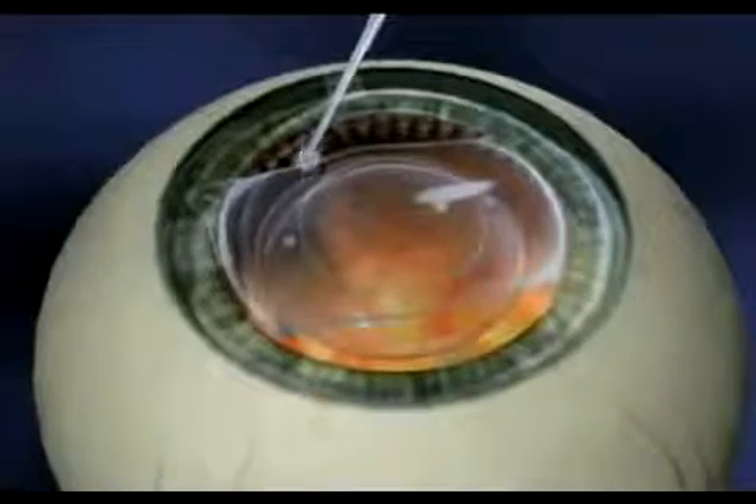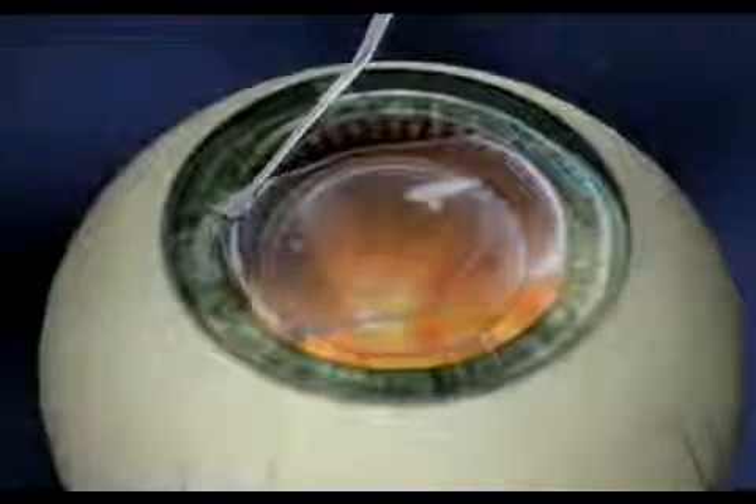Once the lens has fully unfolded, the four corners of the lens will be placed behind your iris. This makes the lens invisible to both you and others.